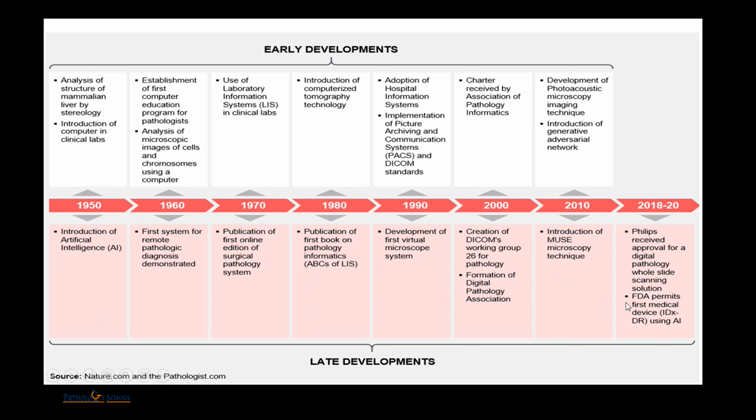More recently, in 2018-20, Philips is the only one that received FDA approval in the field of digital pathology for whole slide scanning. And though it is not related to our topic of discussion, IDX-DR is the first and only medical device in the field of artificial intelligence to get FDA approval, to detect diabetic retinopathy.